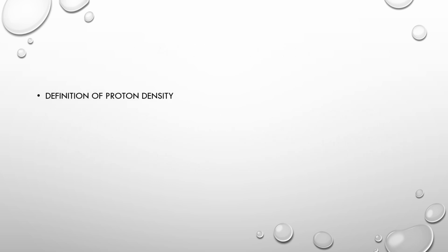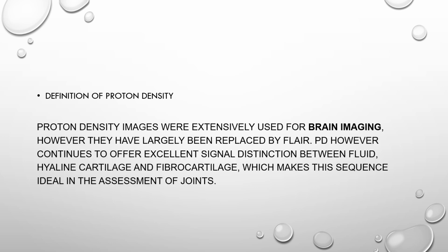The definition of proton density. Proton density images were extensively used for brain imaging. However, they have largely been replaced by FLAIR. However, it continues to offer excellent signal distinction between fluid, hyaline cartilage, and fibrocartilage, which makes the sequence ideal for the assessment of joints.